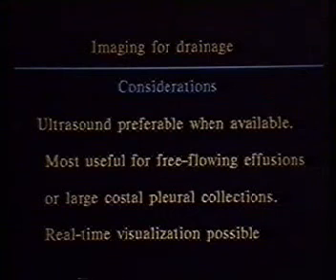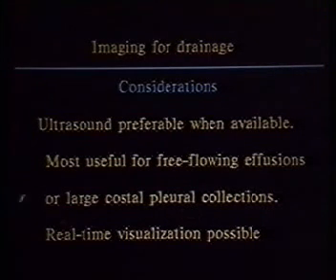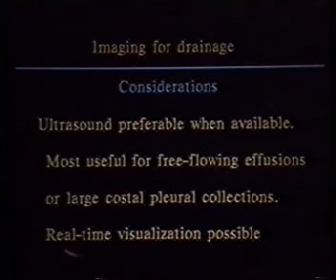It's portable, and it is found to be very useful for those patients who have very large free-flowing pleural effusions or large costal pleural collections where we can obtain an acoustic window in order to guide the drainage procedure. Real-time visualization is also somewhat helpful so that we can actually watch the pathway that our guide wires, dilators, and drainage catheters take during the procedure.